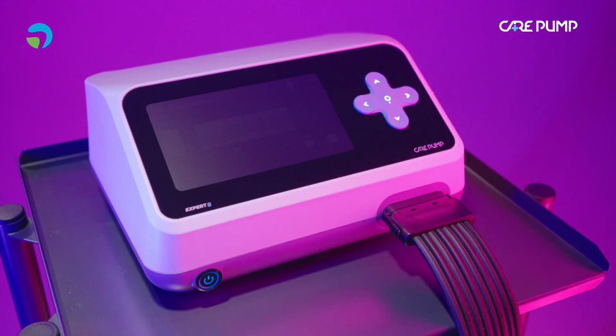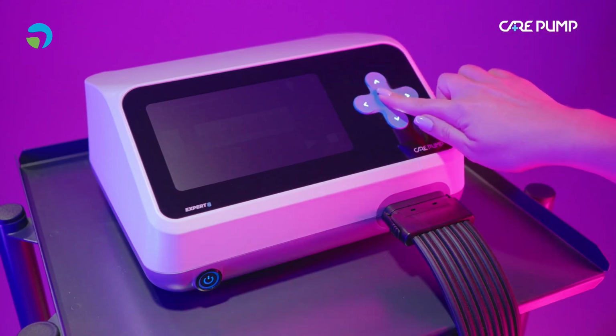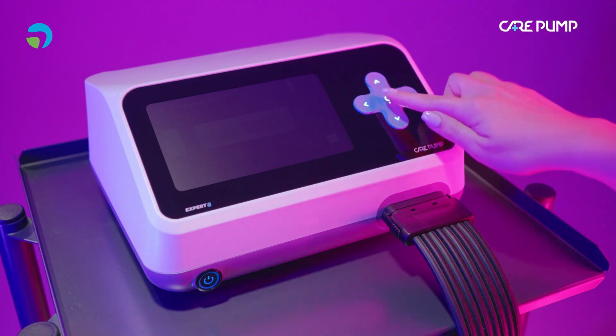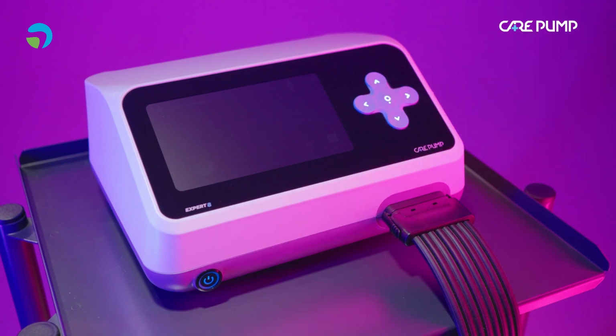Pause. You can resume the treatment in the same way. Therapy start. To end the treatment before the specified time has elapsed, press the middle button of the keyboard. Stop. It will deflate air from the chambers in the cuff and reset the treatment settings.